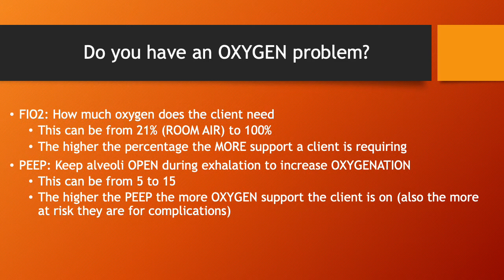Something else to consider is that with PEEP, especially if your patient's on a higher level of PEEP, like if I come in and my patient's on a PEEP of 10, 12, or 15, I need to check what my blood pressure is. Remember all those complications with excess PEEP. I want to make sure that they're not having any other signs of barotrauma or volutrauma, because that extra PEEP can cause damage to the lungs.